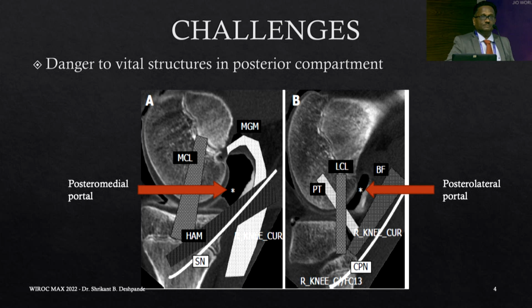Everybody should have the posterior portals in their armamentarium for arthroscopy, because there are some difficult challenges in the posterior portals. One is that there is very limited space, especially the posteromedial portal is having a bigger space than the posterolateral portal, and there are many vital structures in the vicinity of the portals. The asterisks are showing the posterior portals.